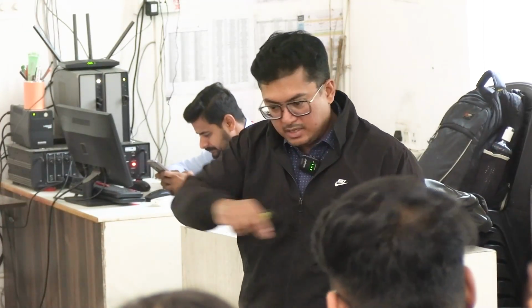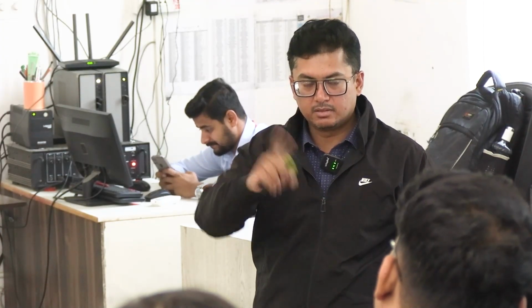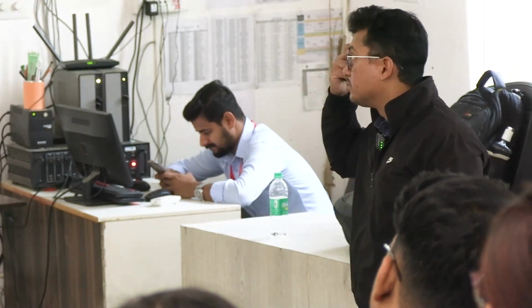হোয়াট হ্যাপেন, দিস অ্যান্টিজেন যেটা তুমি ভাইরাসটা নিলে কারোর থেকে, সো দ্যাট ইজ অ্যান্টিজেন, যে কার্ডটার মধ্যে দেওয়া আছে, দেয়ার আর অ্যান্টিবডিজ coated with some gold nanoparticles. So whenever you have an antigen in that solution, you give onto the card, so the antibody binds with the antigen. Whenever there is a binding, the gold nanoparticles give off and they give a color. Simple. So that is the basic principle of immunochromatography.